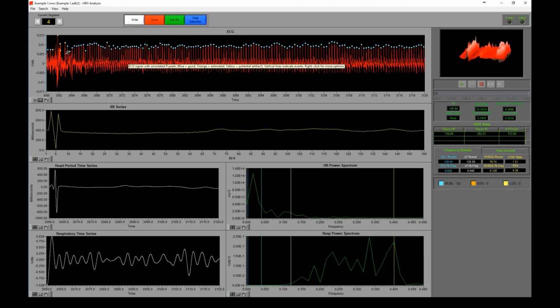Okay, so here we see maybe a bit more noise. We definitely see a huge increase in heart rate. We jumped quite a bit ahead in the file for this example. We're out at 3,000 seconds, so almost 2,000 seconds later than what we were looking at before. Some sort of exercise paradigm is taking place here. We have a very high heart rate.